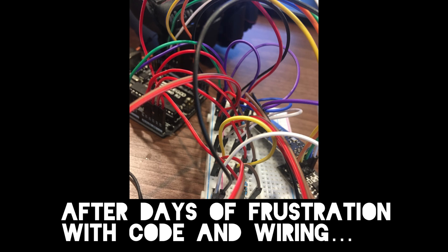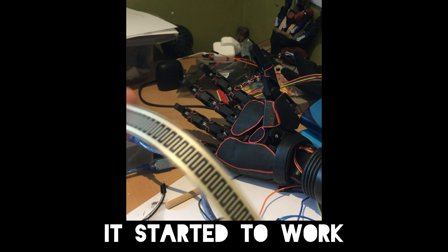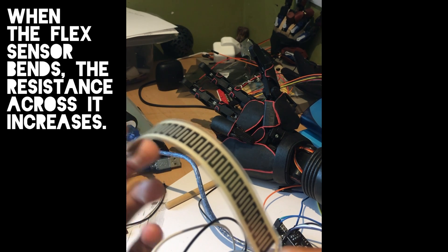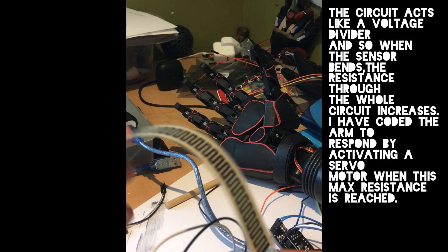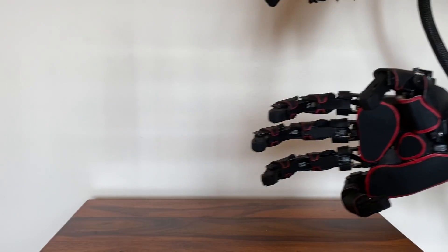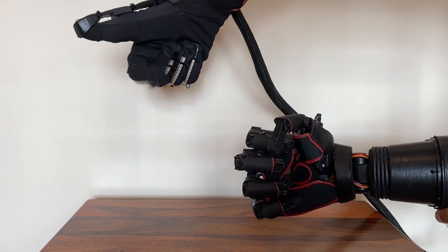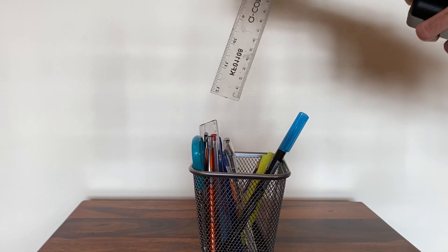It took many days to wire the circuit up correctly. However, after some intense trial and error, it started to work. Currently, this is what the bionic arm looks like and how it functions. Whenever I move my fingers, the bionic arm will mimic. I can even make it pick up and hold onto objects.